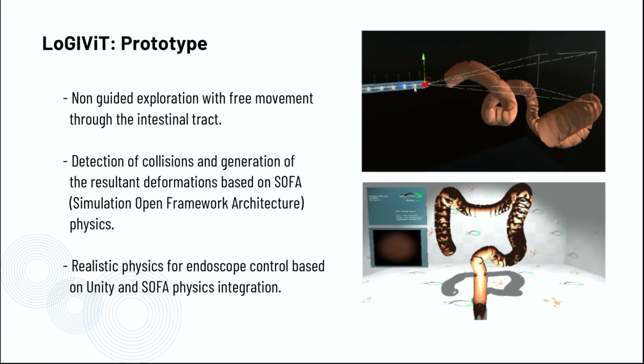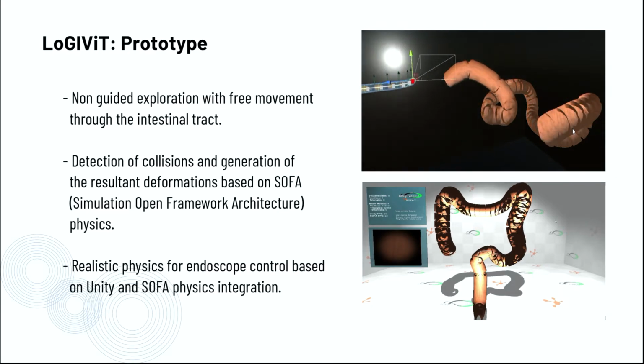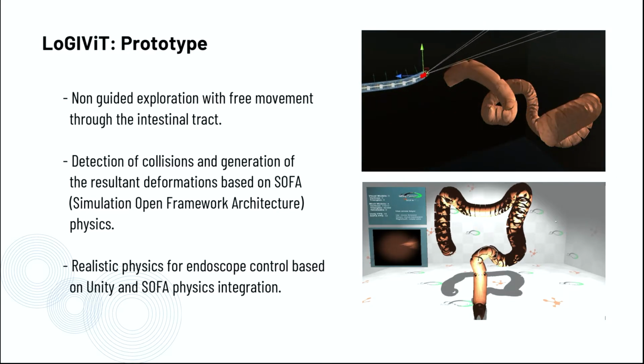Non-guided exploration was also tested by developing an endoscope model with free movement through the intestinal tract. Physics, mainly collision detection, and the resultant deformations between endoscope and large intestine were also tested based on Unity and SOFA physics integration.